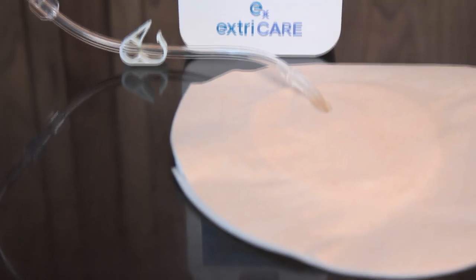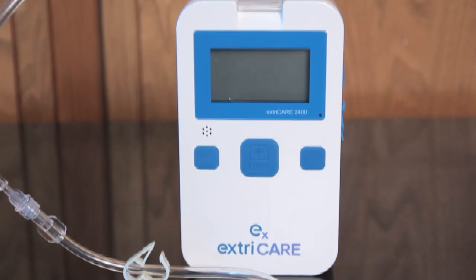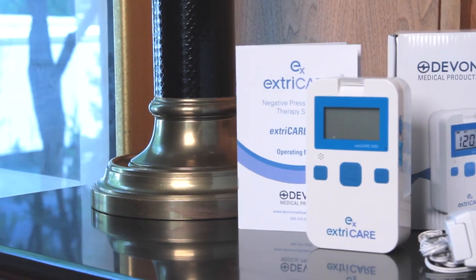proprietary anatomically fitted bandages. Our instructional video series demonstrates how to apply our bandages and how to use the extriCARE system.